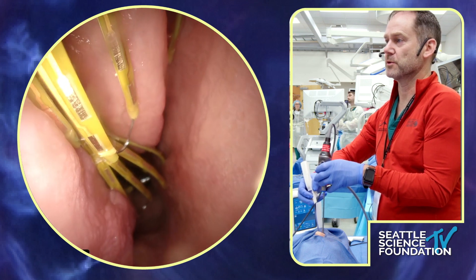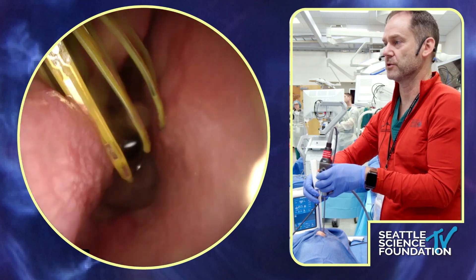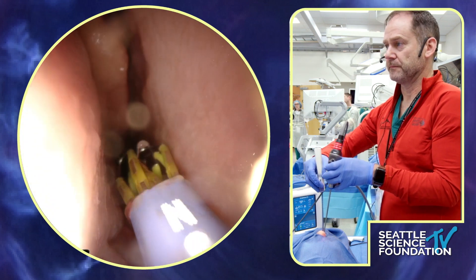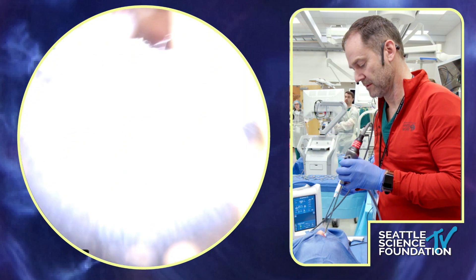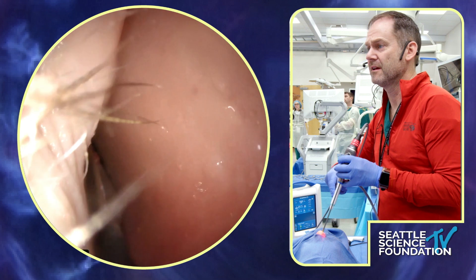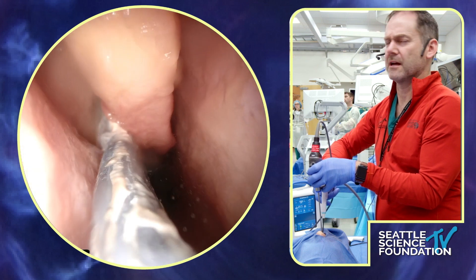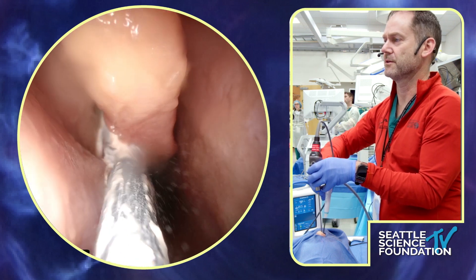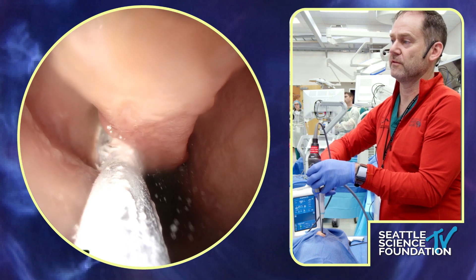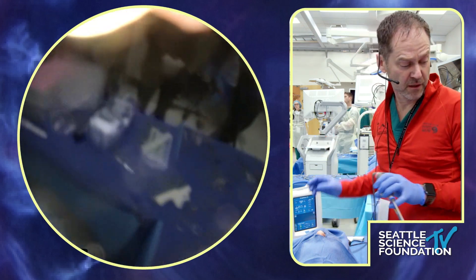It makes little micro-lesions to the posterior nasal nerve — very atraumatic. You can see it wraps around the middle turbinate, but these leaflets are doing nothing until you switch to the other side and tell the machine. One more shot with the Clarifix so you can see the snow effect — and it's 30 seconds. After you do it, you want the patient to breathe in and out until you see those crystals dissolve. If you pop it off when it's frozen and stuck, it's like your tongue on a frozen flagpole — not a good idea.